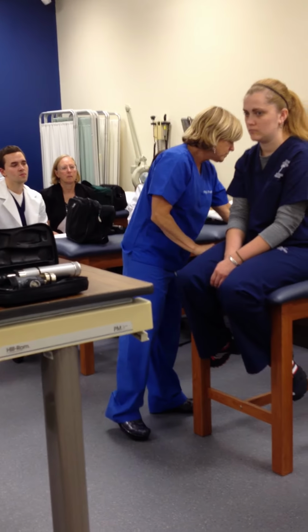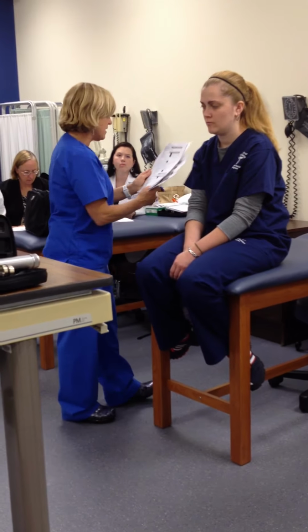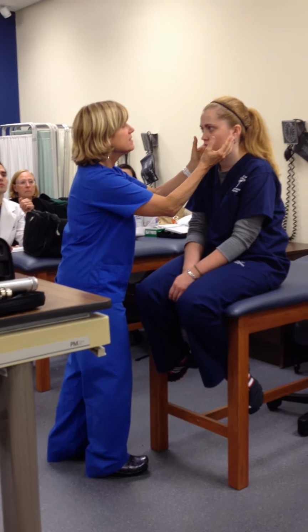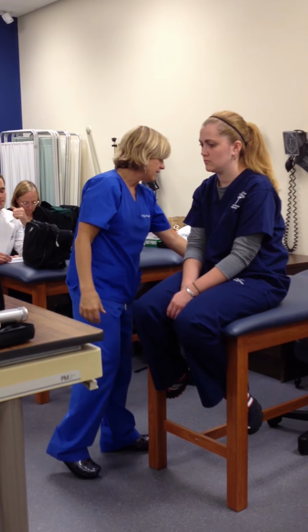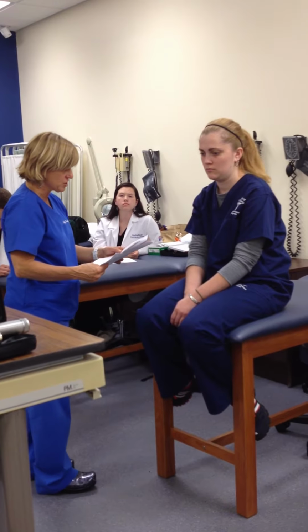And then we're also going to look at the conjunctiva, the corneal clarity, and the iris for its condition. And I would like you to just give the context. Just pull down a little bit and look at the conjunctiva. You'd be looking for erythema, but you're just stating that you're looking at the condition.